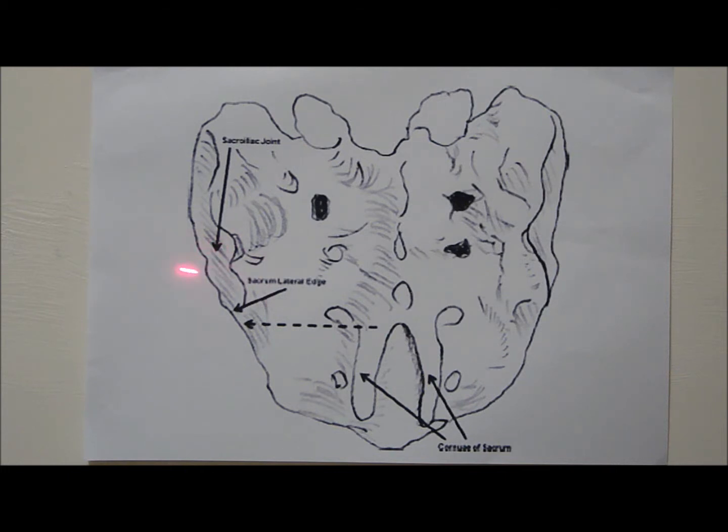The cleft between the bony contours of the sacrum and the ilium represents the lower third of the sacroiliac joint. Because of its synovial component, this is the portion of the joint in which the injection should be performed.